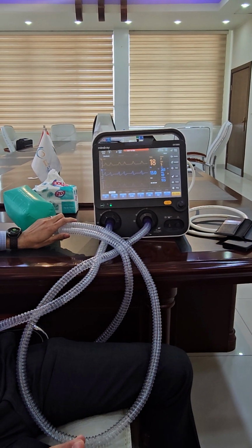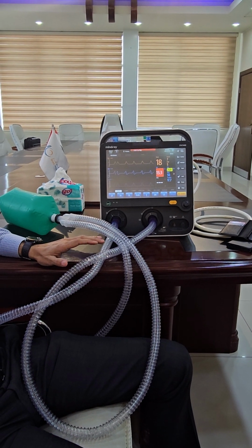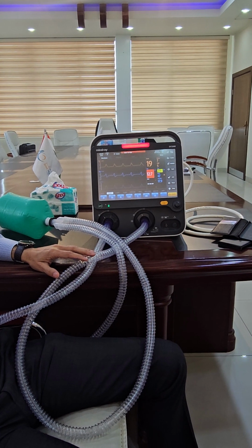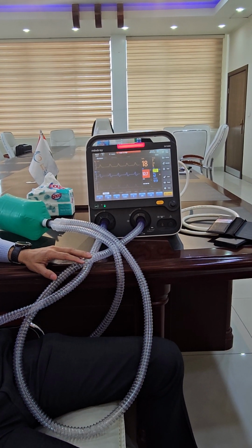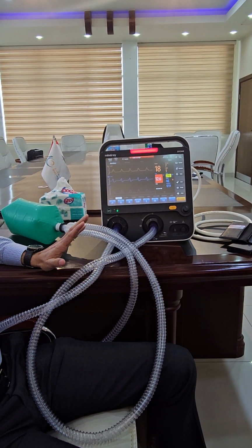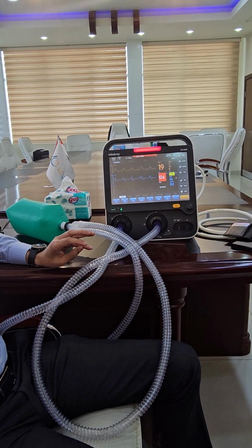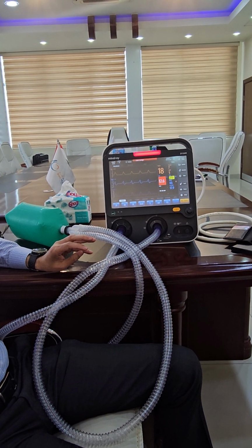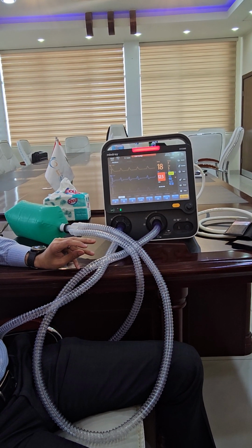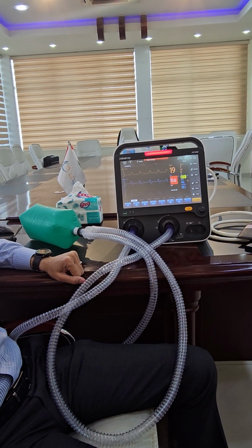Remember the dependent, and then we have the type of breath. How many? Mandatory, assisted, spontaneous. It's very important, so let's repeat. We have type of breath: mandatory by machine, assisted by machine and patient, and spontaneous. Conditional variables: dependent and independent, and phase variable. Three give you mode of ventilation.